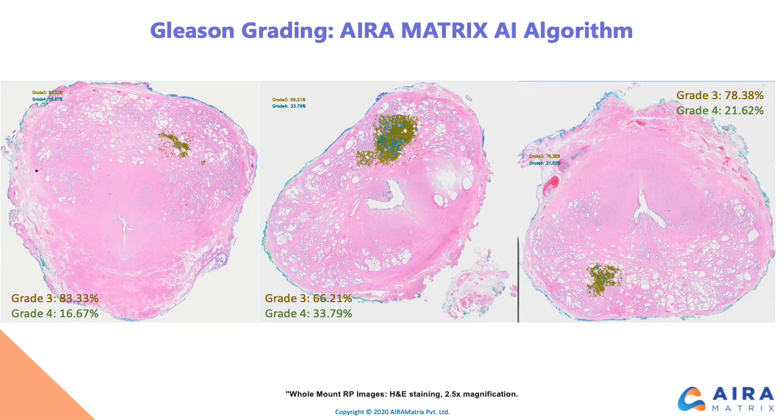Here we show the qualitative performance of our algorithm and the percentage area of each of the Gleason grades. Besides the core level score and quantification, the system also outputs pixel level overlays. Pathologists can use these overlays as a second read to confirm that no area from the image is missed from analysis, in addition to improving the accuracy and precision of Gleason grades.